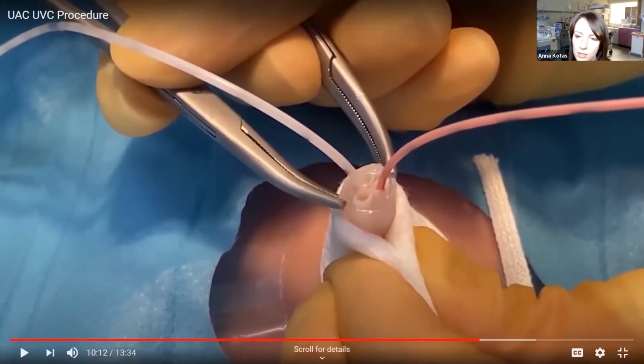To check that you've put the catheter in a vein or an artery, one thing that you can do is aspirate a little bit of blood so that you can see it in the catheter, then pause and watch to see if it pulsates. If it pulsates, then you know you're in an artery, because a vein will never do that.